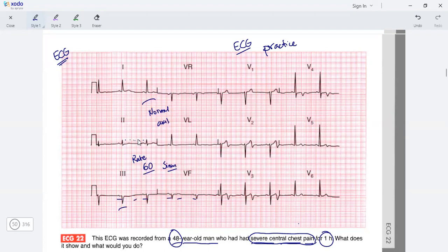T waves appear normal in most leads. V5 shows maybe some T inversion, V6 is all right. In V1, the T is tall. Here there is a biphasic T wave with T inversion in the lesser portion. This is the Wellens pattern. This patient will have presented with central chest pain.